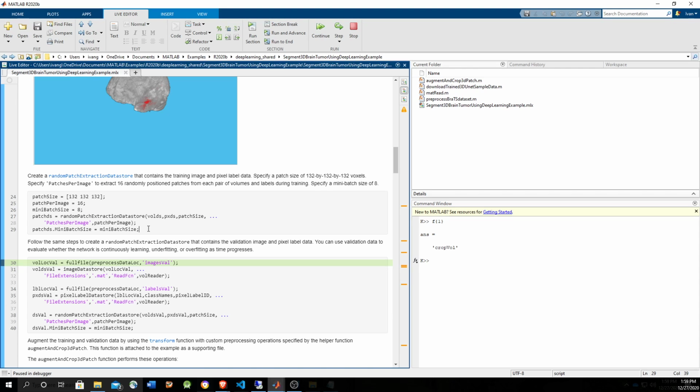Because if you are overfitting, you can get to a precision of 99% with the training data, but then you can have 70% accuracy with the validation data, and then you realize, okay, I'm overfitting. I need to do better generalization, and that's when you enter regularization strategies.